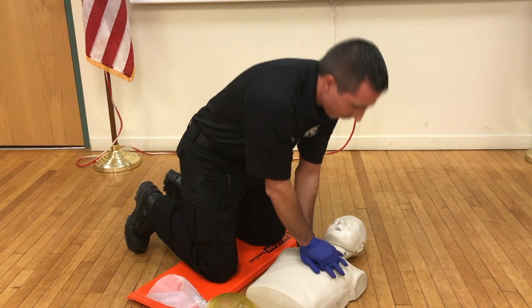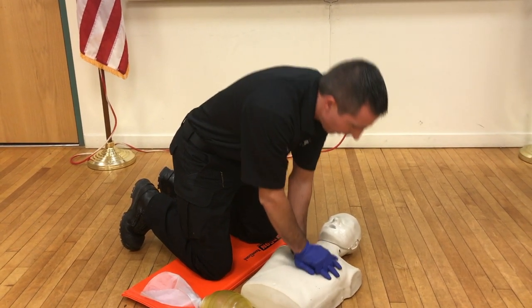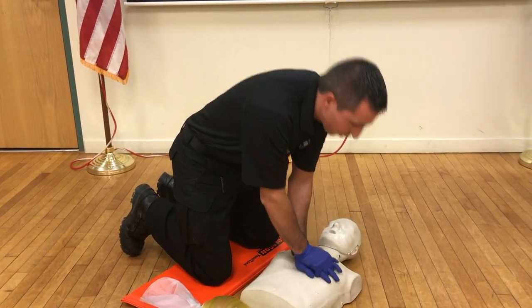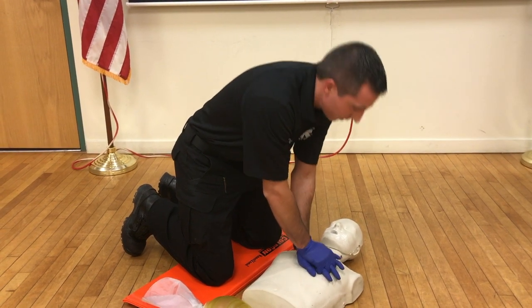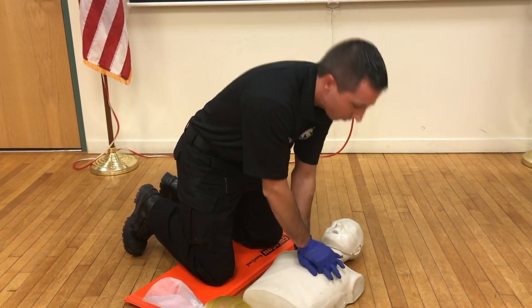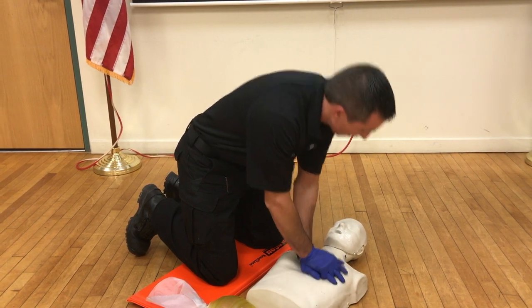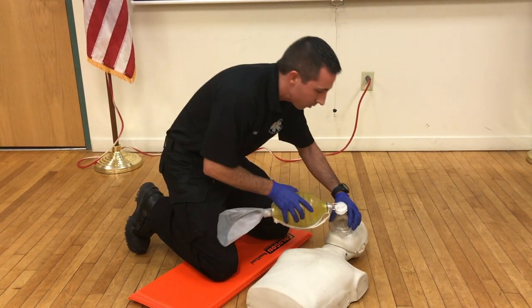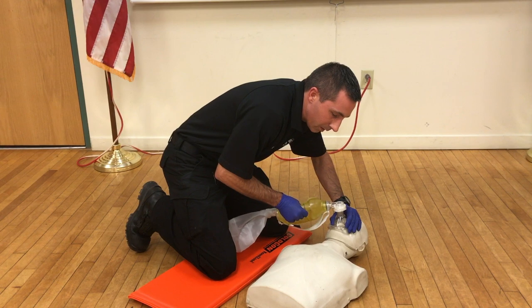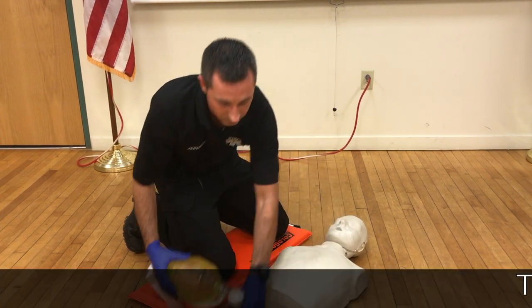Performing 30 chest compressions: 1, 2, 3, 4, 5, 6, 7, 8, 9, 10, 11, 12, 13, 14, 15, 16, 18, 19, 20, 21, 22, 23, 24, 25, 26, 27, 28, 29, 30. I'm going to give two breaths — opening the airway, making sure I have a good seal, making sure I have a good chest rise.